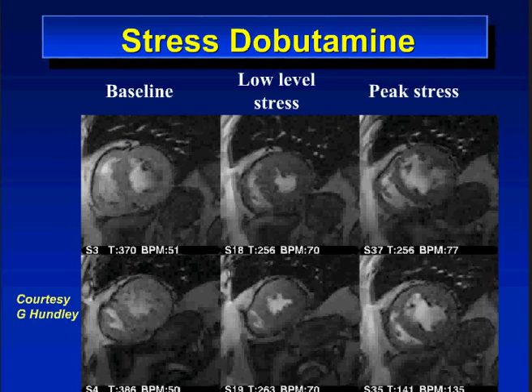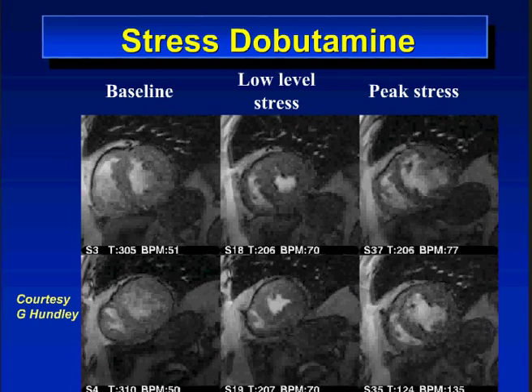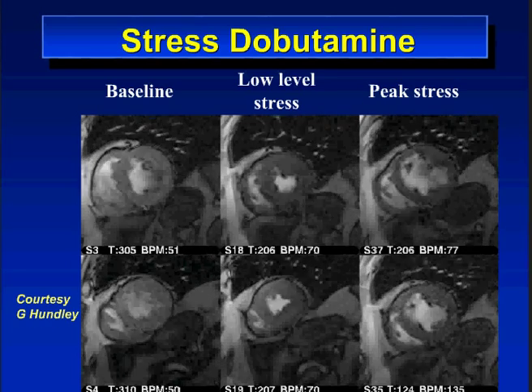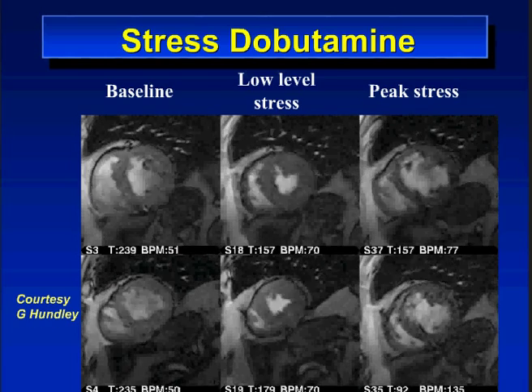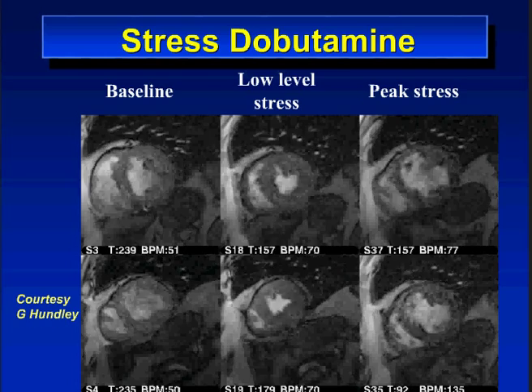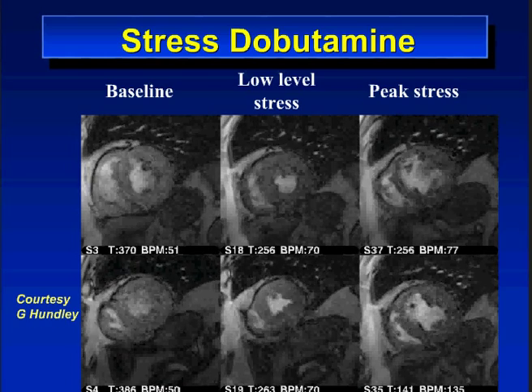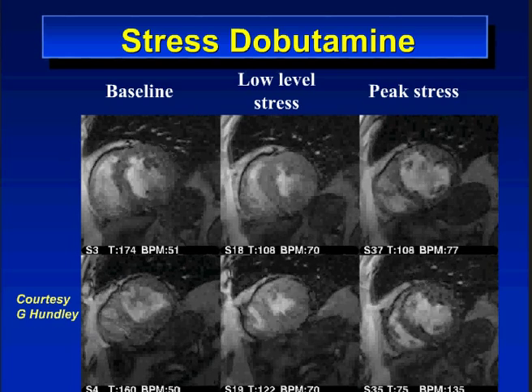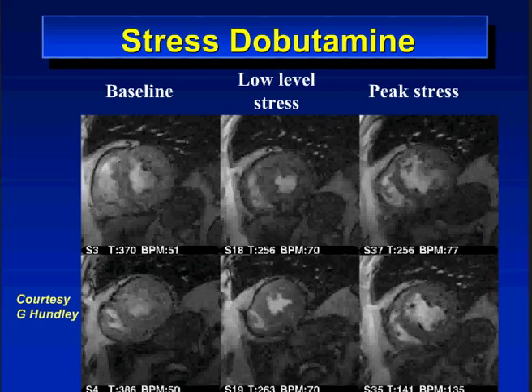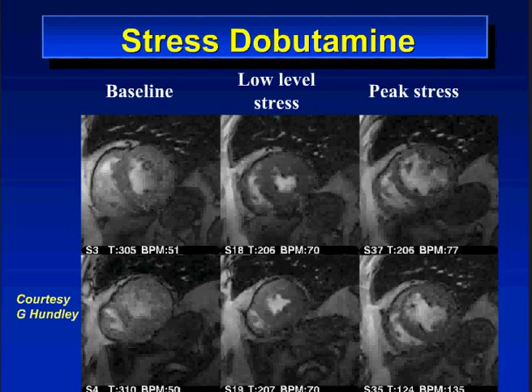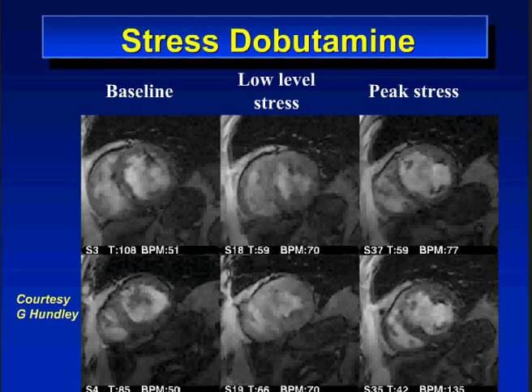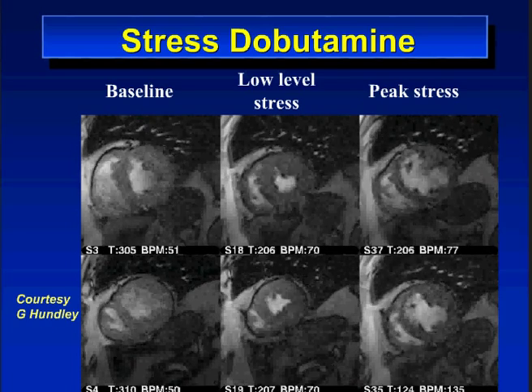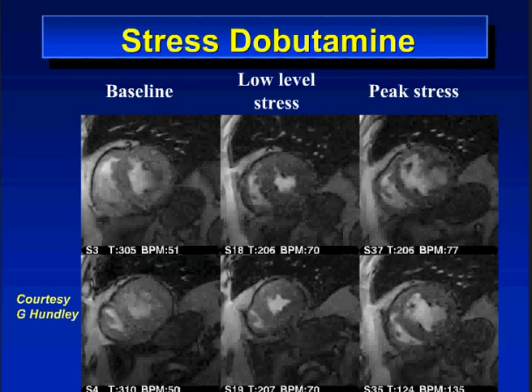This is an example of stress MR courtesy of Greg Hunley. You can see relatively poor wall thickening at baseline. At low-level stress there is good thickening, but at peak stress there is poor thickening in the septum, indicating ischemia there at peak stress.